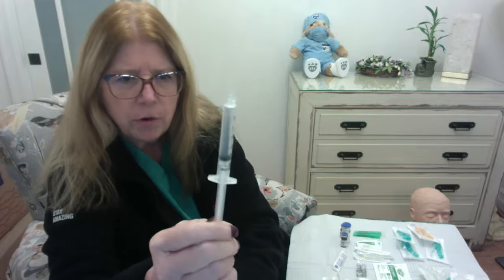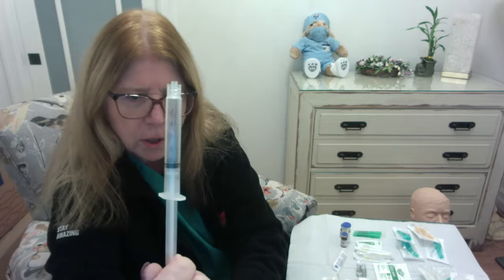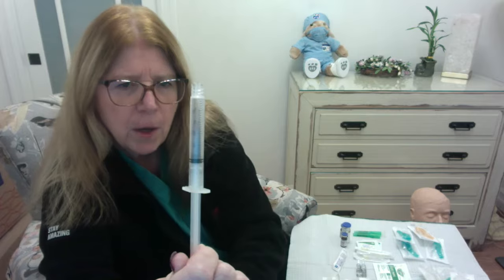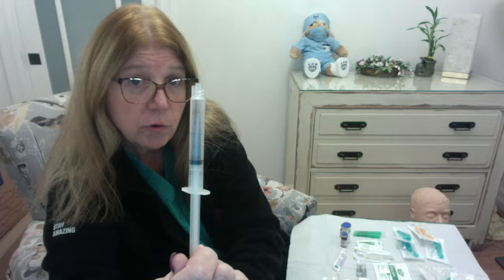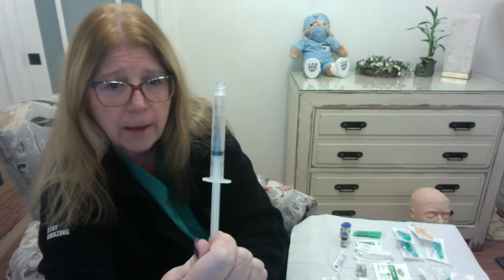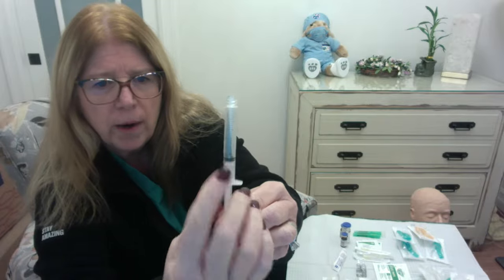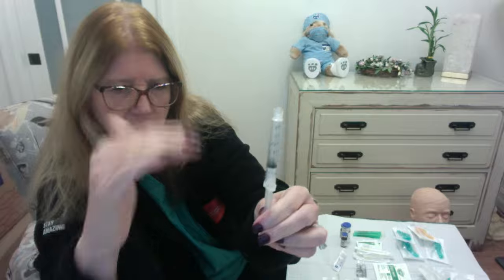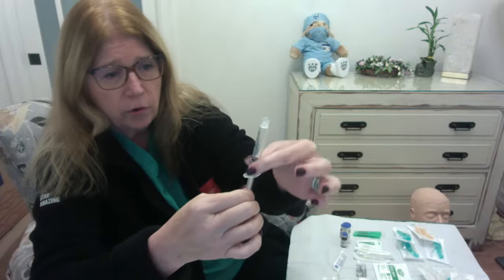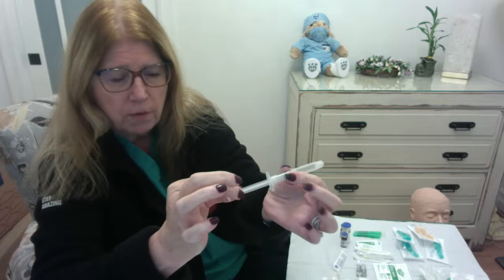Now what's important to note here, I'm just going to flip this around for a second. I want you to have a close look and notice those two black lines. When you're drawing up medication into a syringe, you're always going to be looking at the top black line. This top black line right here is where you are looking in terms of how much medicine you actually have in that syringe. So this is called the barrel of the syringe. This is called the plunger of the syringe.